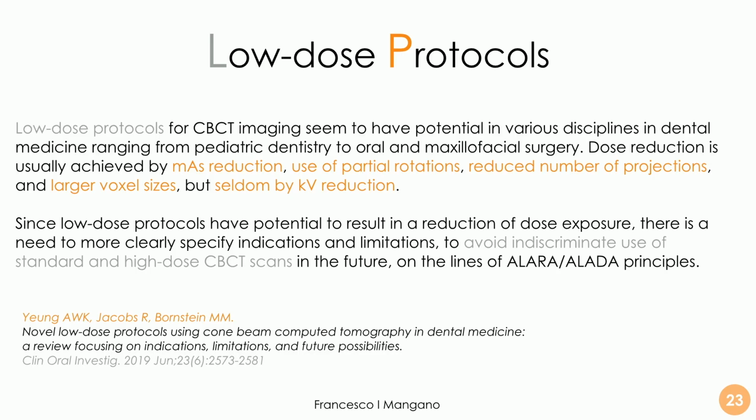Particularly interesting is this trend of searching for low-dose protocols in order to reduce, for example, the number of projections, and it's possible today with the modern machines to dramatically reduce the doses given to the patient, following the standards given by the ALARA and ALADA principles.